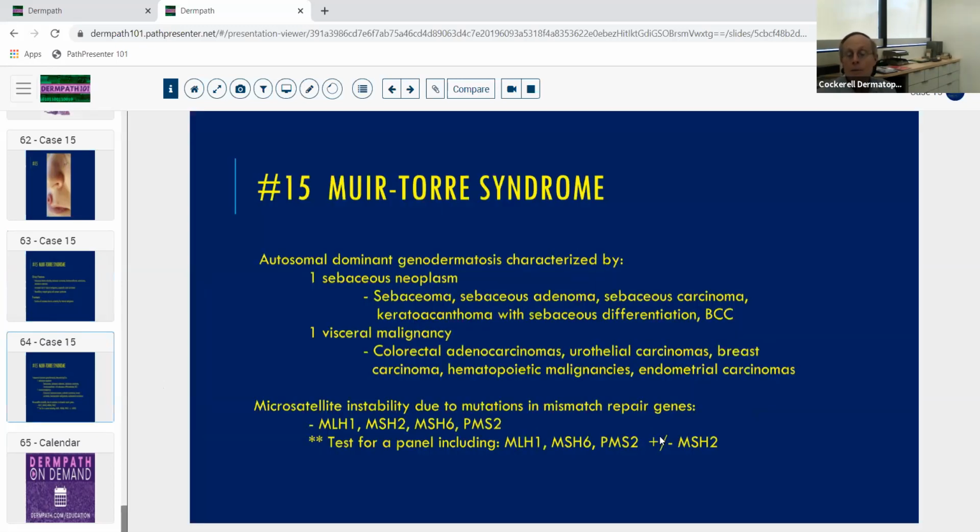They don't have to be colon cancers. They can get other things too, urothelial, breast. So just realize that you need to know all of the various kinds of cancers that can be associated with that. So we do this panel of stains on these patients. We're looking for loss of some of these markers as opposed to things like aneuploidy, like in a melanoma. Here, this is kind of analogous to a BAP1-mutated nevus, where you're looking for loss of the staining.